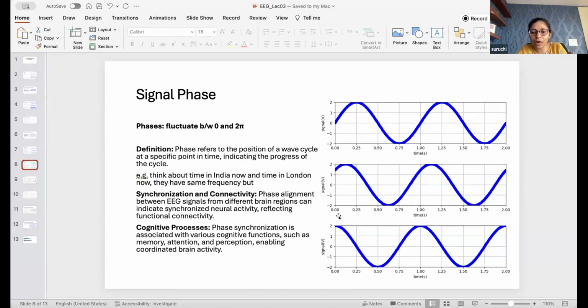So you don't have to start from zero, right? If you started from 0 to 1, you can't tell exactly, but if you took a longer time interval, then you can count in 10 seconds how many peaks there are. So the idea here is the frequency is the same.